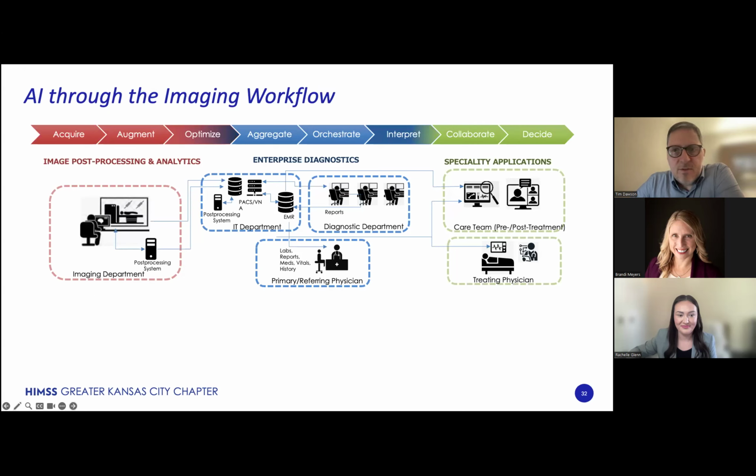So here's an example of a full enterprise imaging workflow, from image acquisition to post-processing, optimization, and then enterprise diagnostics, interpretation, and then finally to collaboration and decisions. Each step of this workflow can be enhanced. As an example, generating improved reconstructions and enhancing image quality with lower dose.